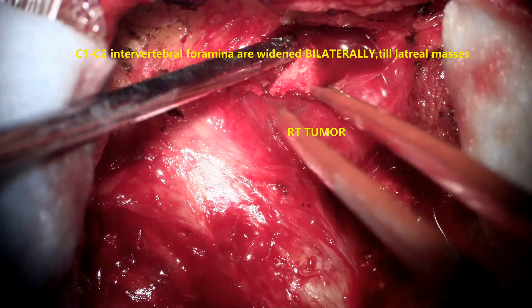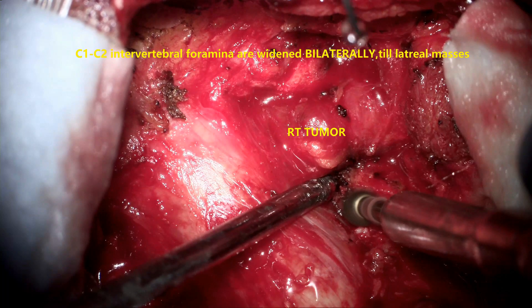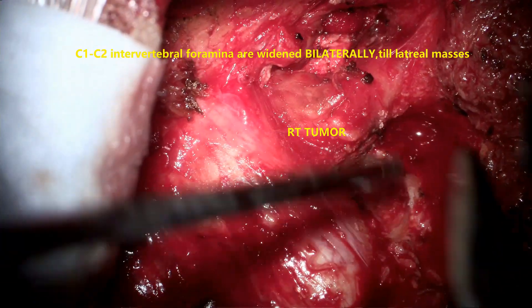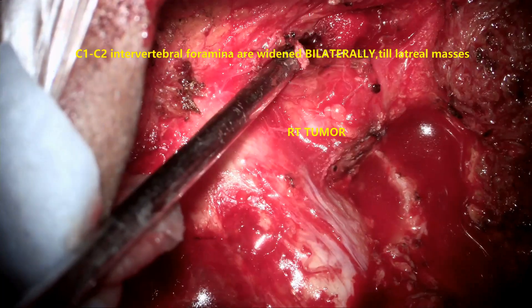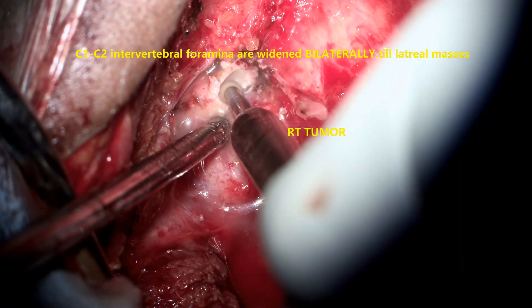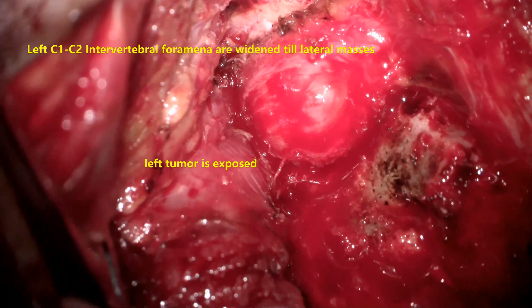It is very important to expose this region so that you can excise the tumor comfortably, go superiorly into the dura, and see if it extends inside the dura. The lateral masses are drilled and exposed up to the intervertebral foramen where the root exits — we need to follow the roots to take off the tumor completely. Once the bony work is done — C1 posterior arch removal and C2 laminectomy both up to the lateral mass — the whole C2 root is exposed on both sides.